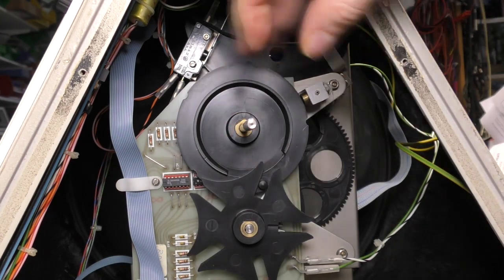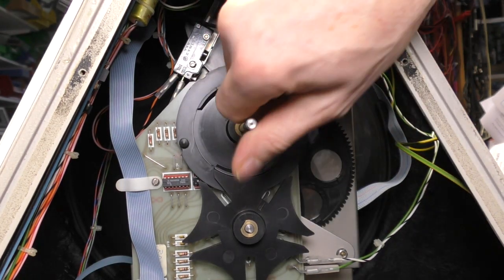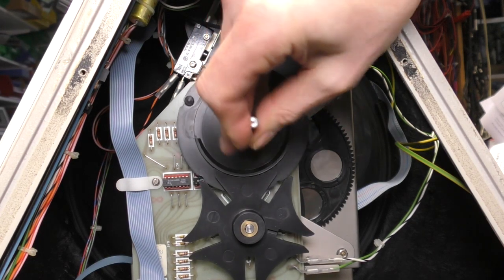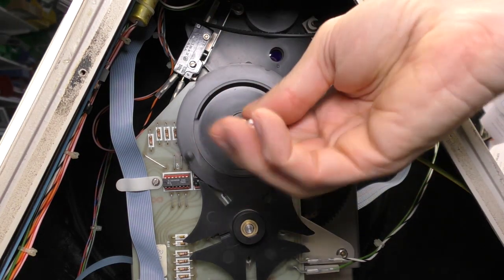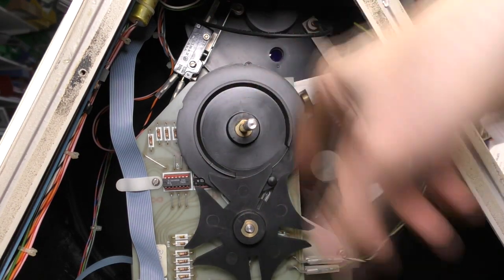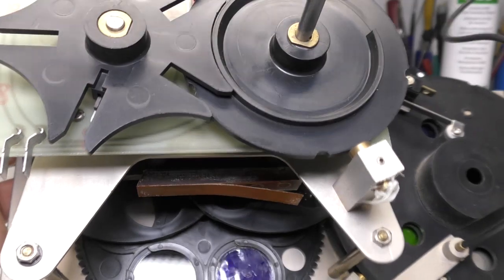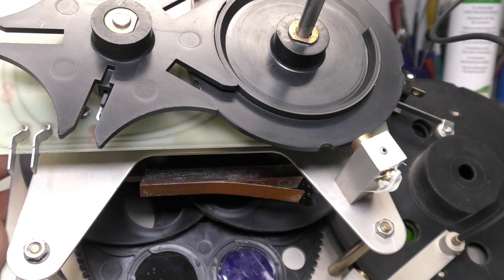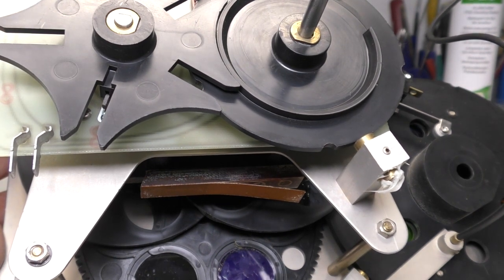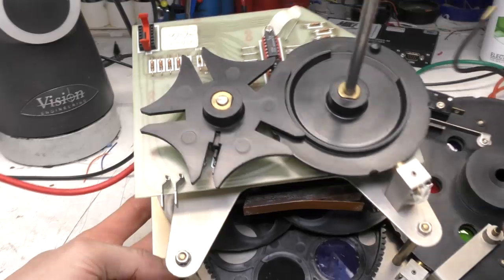And this knob is for the density control. This actually goes through multiple turns, and you see there's this second thing here. So I suspect we've probably got two different filter wheels, a coarse and a fine, like a fine wheel on here and a coarse wheel on here perhaps. Finally managed to get this optical assembly out. It's a real nightmare the way they've put it together, the screws are really hard to get to because of the weird shape of the case and the fact you've got to get it out through a fairly small hole compared to the size of the case.